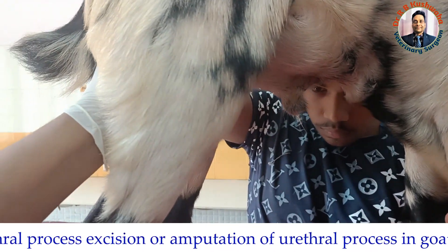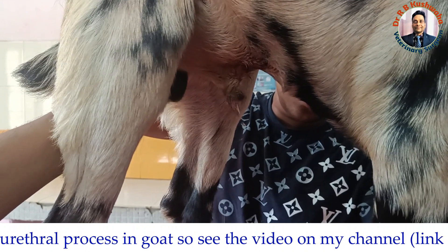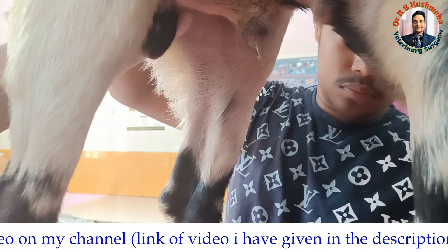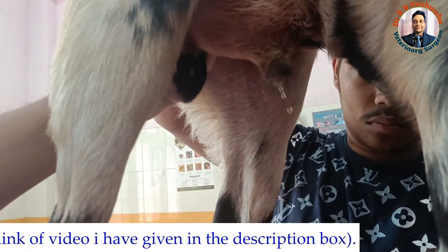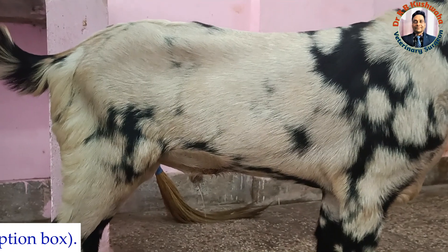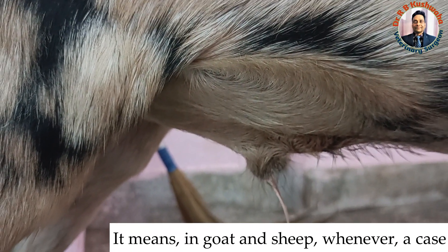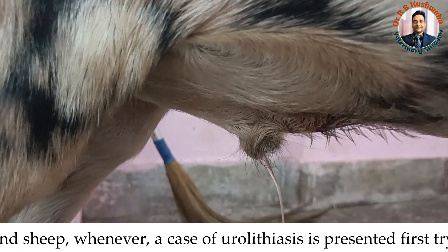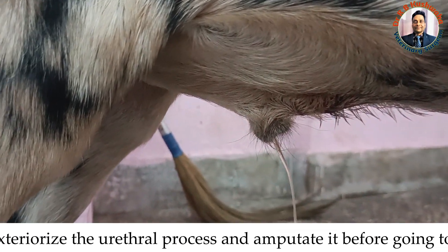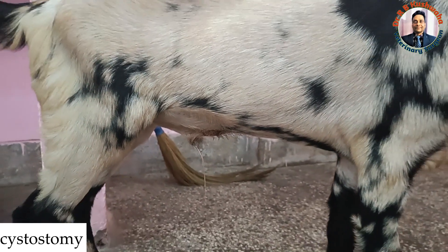You can see that by manipulating here there is a flow of urine. In this way you can manage urinary obstruction in the goat. Before going for tube cystotomy, first examine the urethral process. If there is any obstruction, go for the amputation. If after the amputation there is no urine flow, then you can go for tube cystotomy. This is the only message I want to convey through this video.